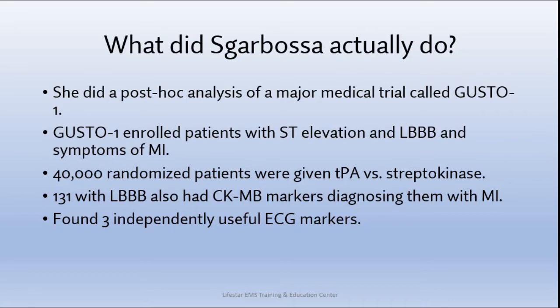And she said, we got a lot of data here and a lot of 12 leads, and we have a lot of patients that were having an MI. So let's take a look at the ones that have left bundle branch blocks and see if there's anything in them, if we look at enough of them, that we can find a marker that can tell us how to interpret STEMI, even with that left bundle branch block.